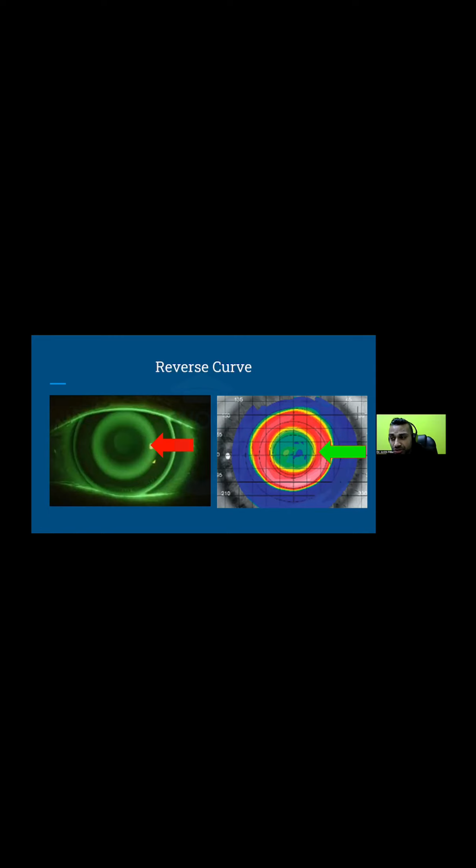And there are two things that the reverse curve does, and it's really where all the magic happens. We'll get into that in just a second. But I want to point out on the tear film layer, all right, we got past the base curve. We see this area of what looks like bearing, right? Which we know it's not, because you still have a little bit of tear film, right? And then you have this really ramping up of steepening into the reverse curve. This is where you get all the way up and you have this nice band of fluorescein.